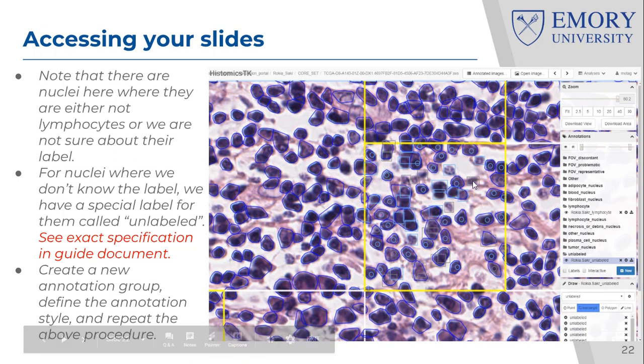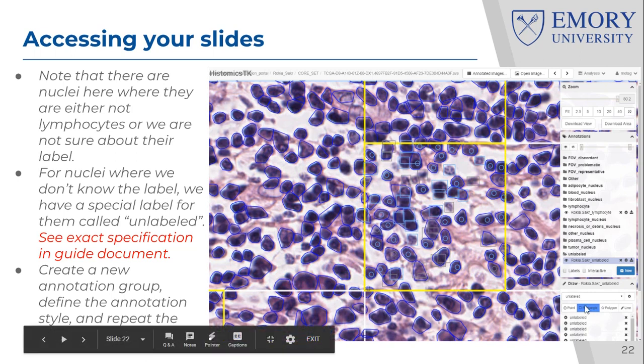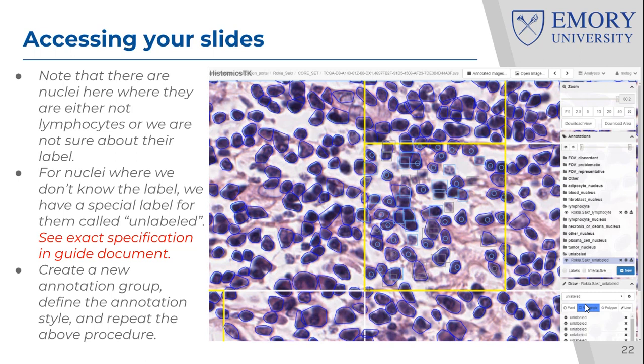And you follow the exact same convention. This is unlabeled. The algorithm didn't even know it existed, so you can just place a rectangle around it. See these gray rectangles? This one, again, the algorithm doesn't know it existed. This one, there are two vague nuclei. Not sure they are lymphocytes, but I don't know what they are, so I make them gray. Again, only use the label unlabeled if you are already confident in your ability and really are sure that these nuclei are vague. In other words, they cannot be labeled in H&E.